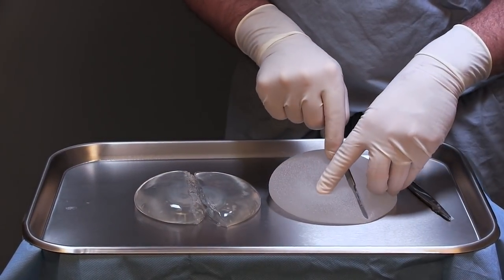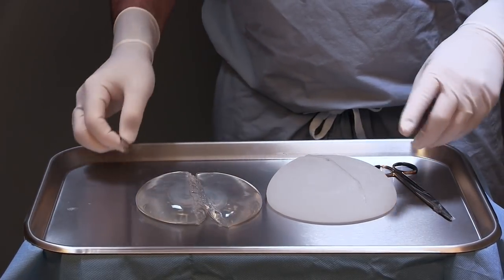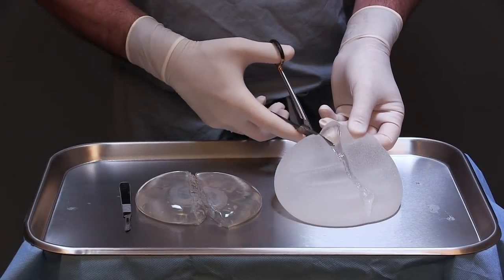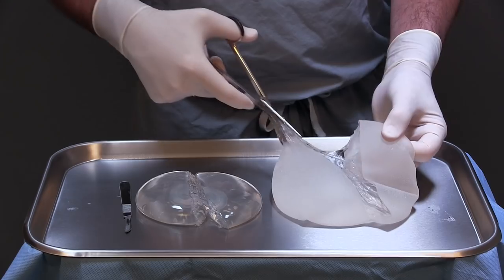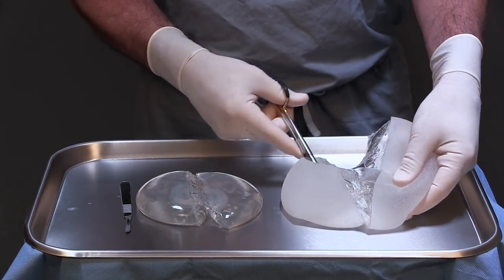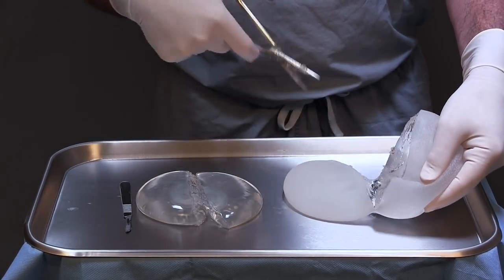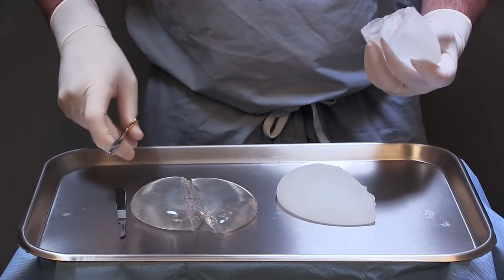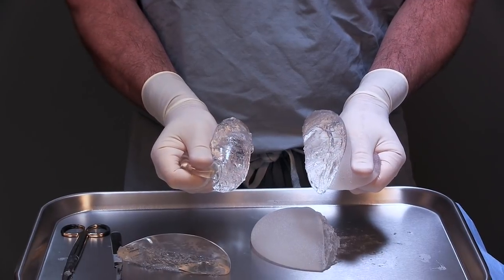This next implant is what the company calls a "gummy bear." The outer shell being frosty is a completely separate subject — it's the gel inside that we're interested in. This is supposed to be a form-stable implant and they claim it is superior to the first one. As I cut it in half, you can see it's still kind of sticky and gooey, sticks to itself quite a bit, and while it probably isn't going to ooze anywhere, it really has pretty much the same consistency as the first one.